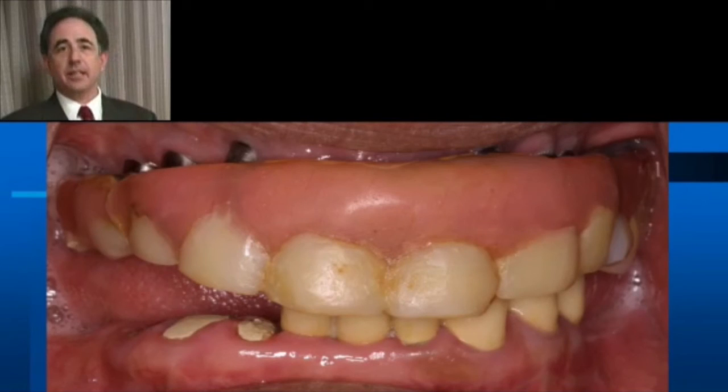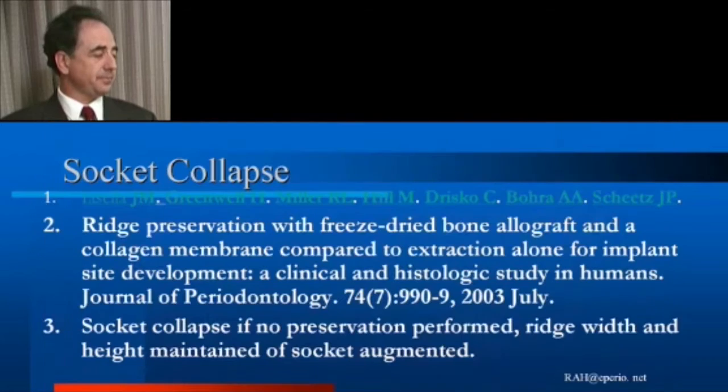In the early days, dental implants were placed at any angle to integrate them into the alveolar bone. These implants were placed over 20 years ago by a surgeon who did anything he or she could to get the implants placed and integrated. Unfortunately, this leaves the patients with dental implants that have their screw access holes at about a 30-degree axis to the prosthesis. This has over time caused weakening of the prosthesis, unfavorable force distribution to the dental alveolar complex, and loss of bone around these dental implants.